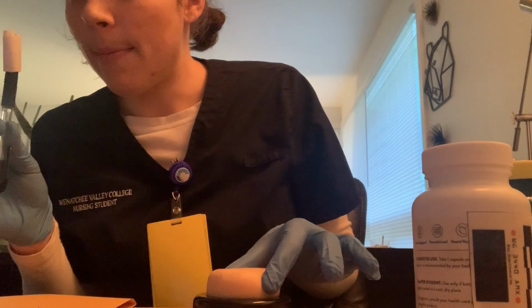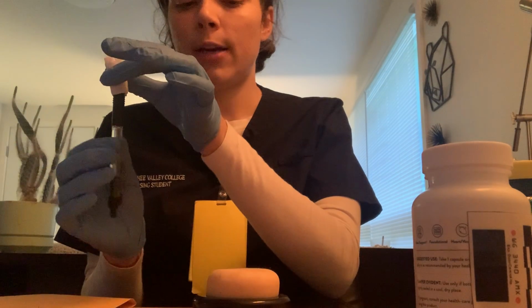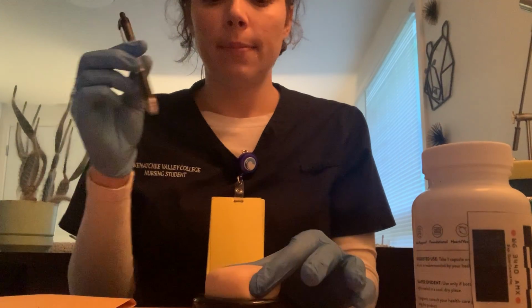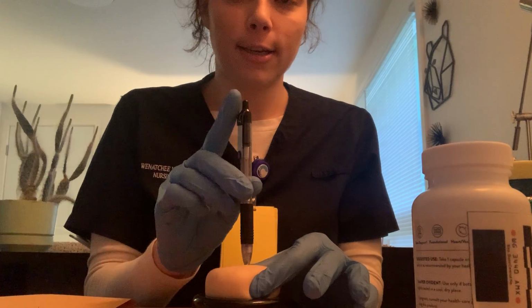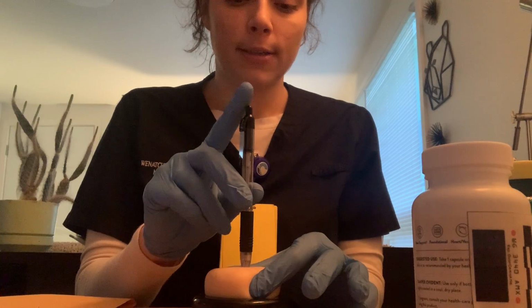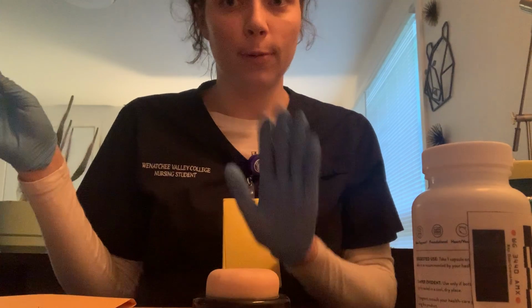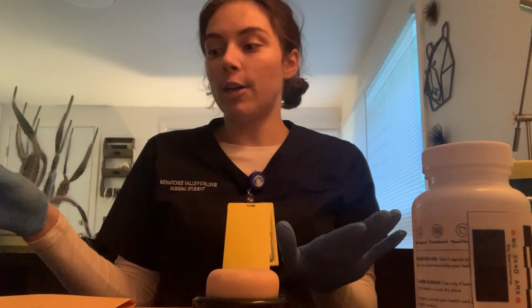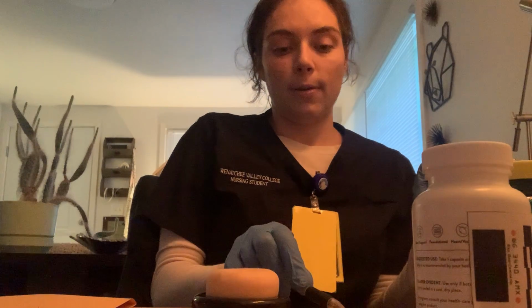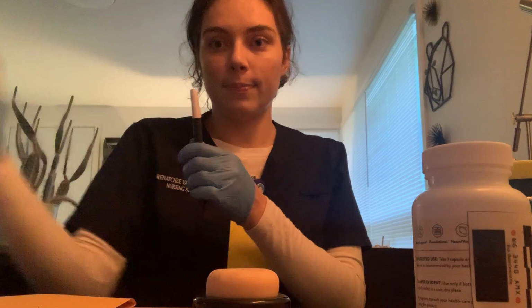I'm going to check my MAR again. That's my third check. We're going to remove the cap. Pinch the skin, insert it like a dart, inject, release. We're making sure that we're not massaging the area. We're recapping safely, and we're throwing away in a sharps container, which is going to be this.